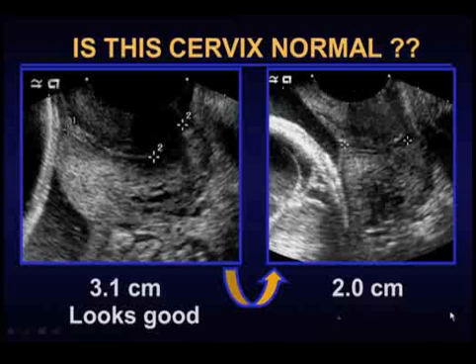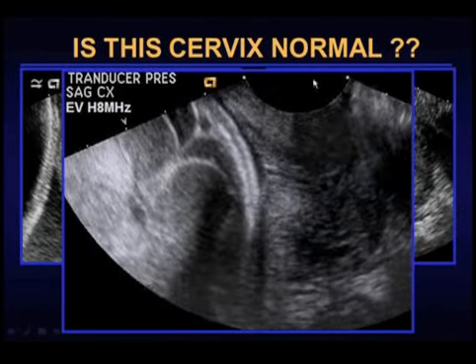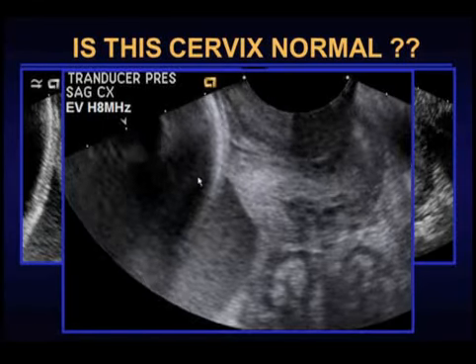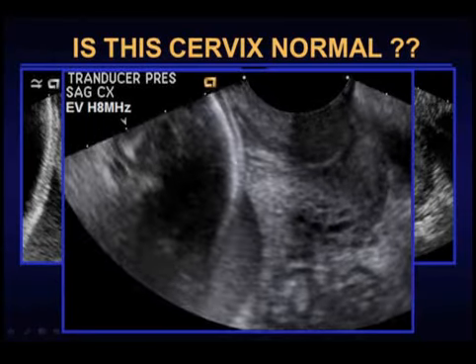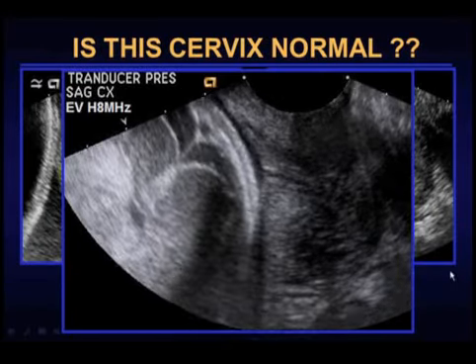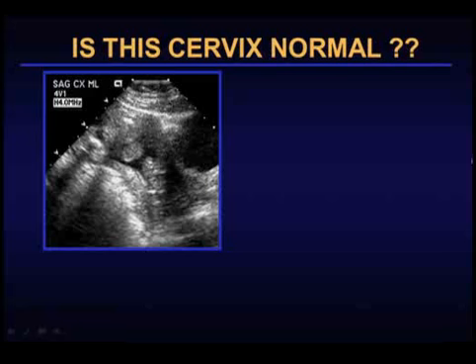And I'm going to show you a clip in this case to show you what's going on. Cervix is too short here, and in the clip now, as I'm releasing pressure against the cervix with the probe, I think you can appreciate it was longer and now it's shorter. It's longer and now it's shorter as I'm pulling back with the transducer. So don't push that cervix, don't make it look closed or longer than it really is by having transducer pressure against the cervix.